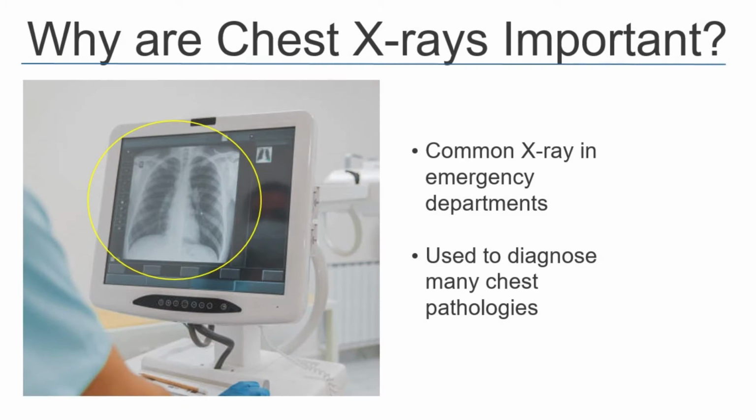Why are chest x-rays important anyway? Did you know that chest x-rays are one of the most common x-rays taken? It's used to diagnose a host of different pathologies, so it's important as professionals and as students that we know how to analyse a chest x-ray in case there are any abnormalities there.